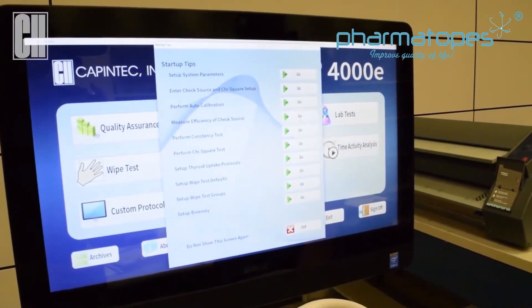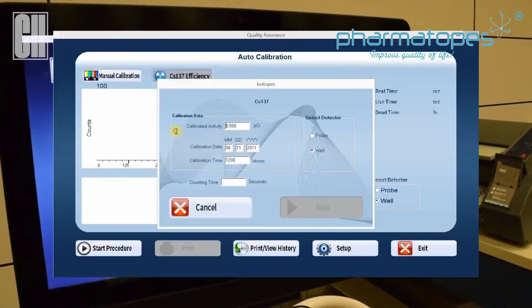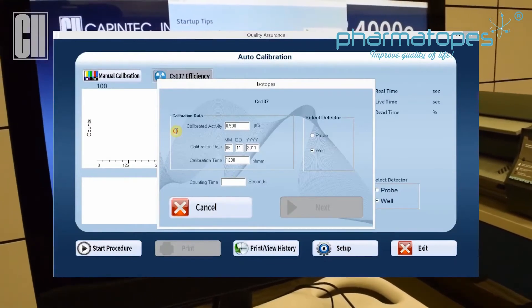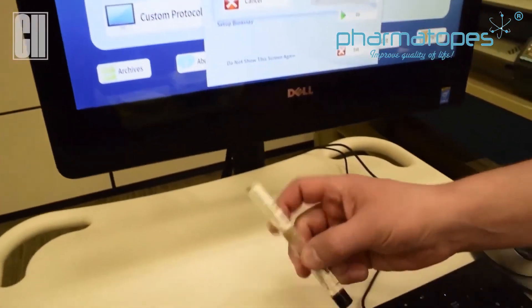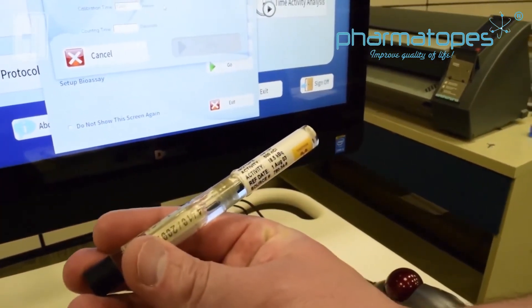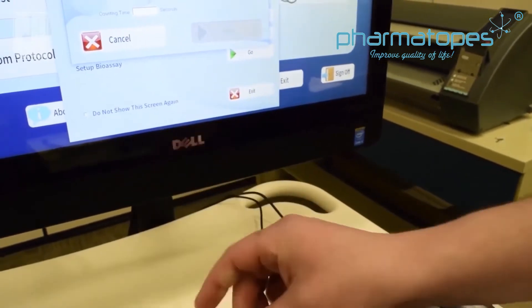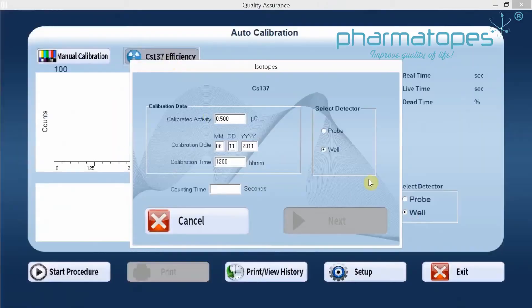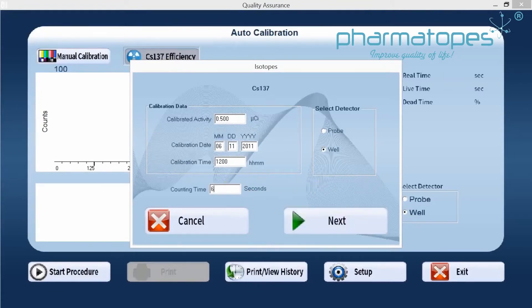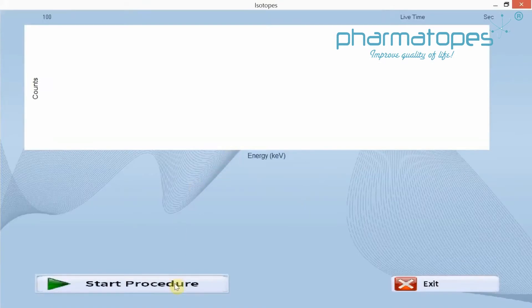Now we'll click on Go, and we want to verify that the source information is still matching what we have on our test source — that should match what's on our label. Once we confirm that it matches, we want to select the detector we're going to measure the efficiency for. In this case, we're going to click on Well, set a counting time, and enter 60 seconds. Once we have that time in there, go to Next, and then Start Procedure.